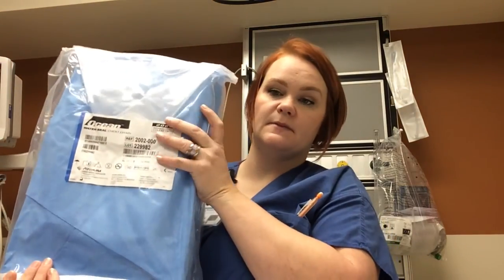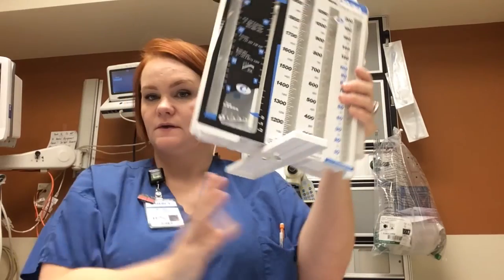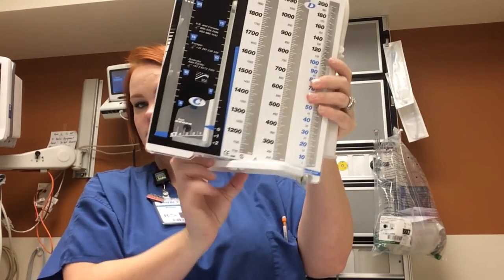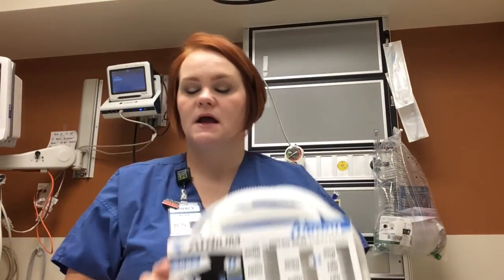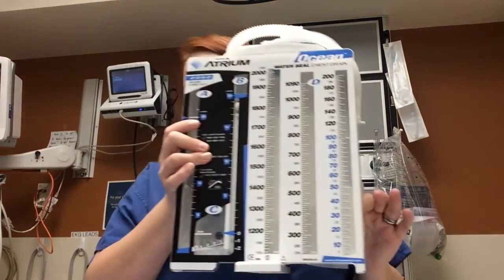On our side of the end, as nurses, we need to be getting the actual water seal chest drain chambers ready. And so again, that's in this big packet. Once you've taken it out of the packet, this is what the device looks like. So you get your device out. It's going to come like this. So you turn it so you have a nice stand. And this is going to be attached just like that.